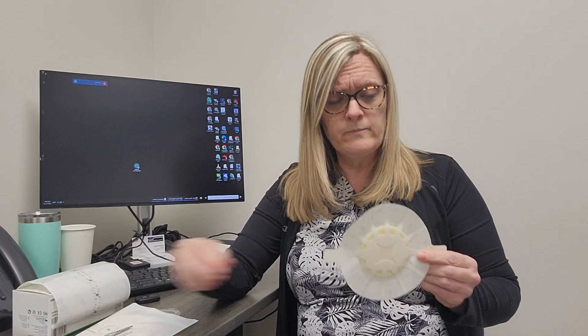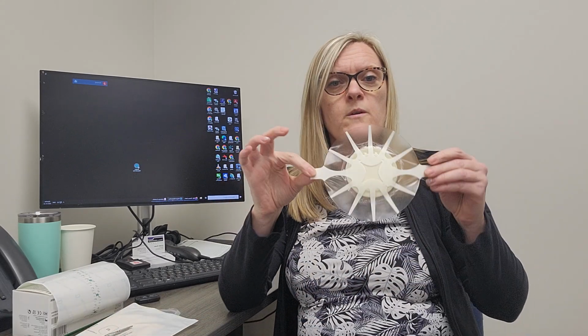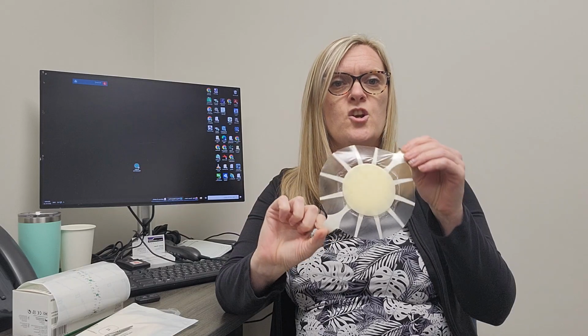Now, currently on the catalog there are some non-adherent foams, but they don't have any tape or any attachment. So I always joke with the nurses in community, because I live over here in the lap of luxury, because I have these fancy little foams. They're called Tegaderm, just literally a Tegaderm high performance foam. The beauty of this is that it's a non-adherent foam, meaning there's nothing on this side that is sticky.